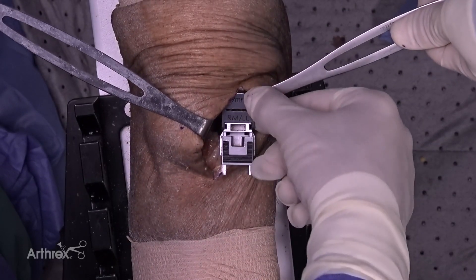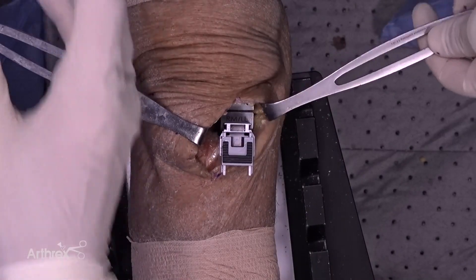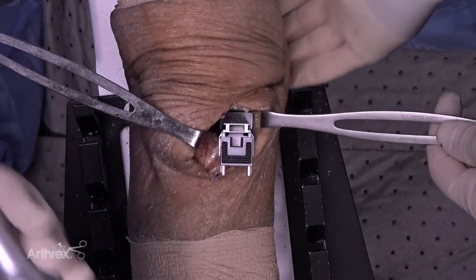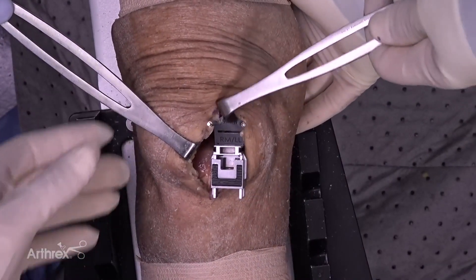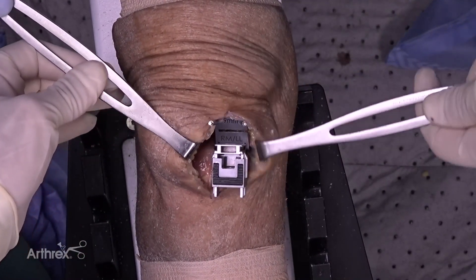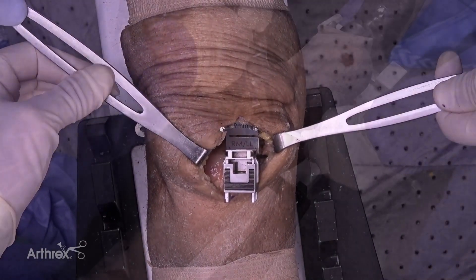I'm going to put a distal femoral cutting guide in — it slides right over the spacer block. Once that's in place, I can place a couple pins to stabilize it. One thing to make sure is we're not extending or hyperextending the knee. We can look in the notch to clearly see there's no impingement — that's a good position for that cutting block.